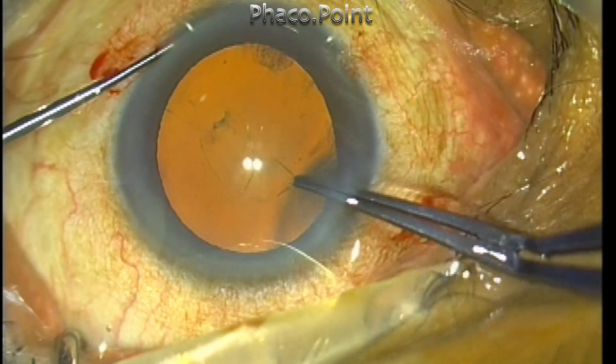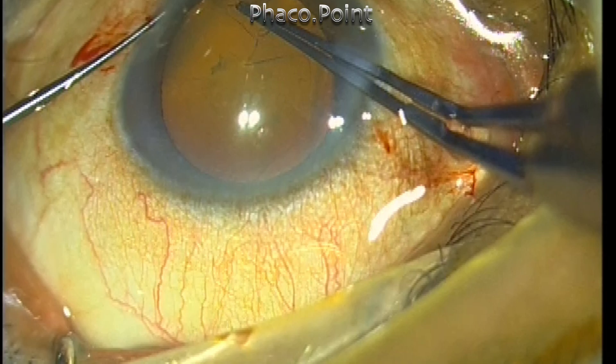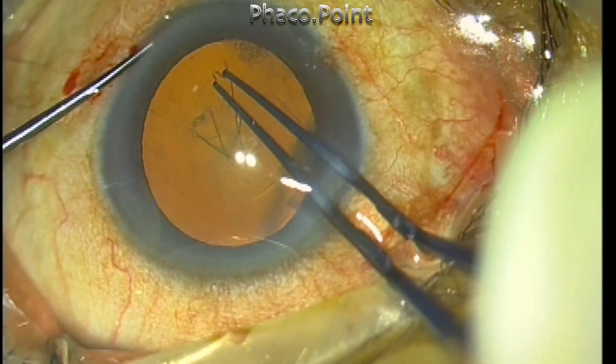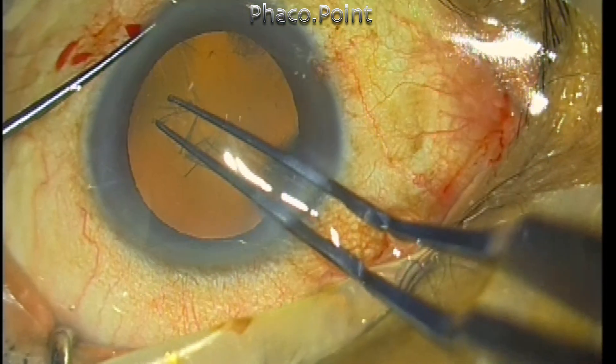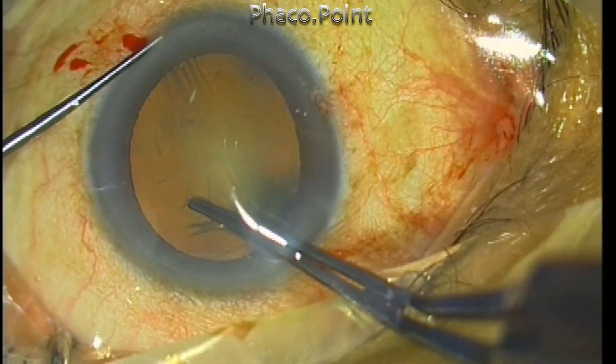The advantage of the corneal pocket incision is that fixation onto the cornea can be done when the patient is being operated under topical anesthesia. The hold is tangential and you don't have to hold the eye with a tooth forceps, which may elicit pain, or a Thornton fixation ring, which may also elicit pain.